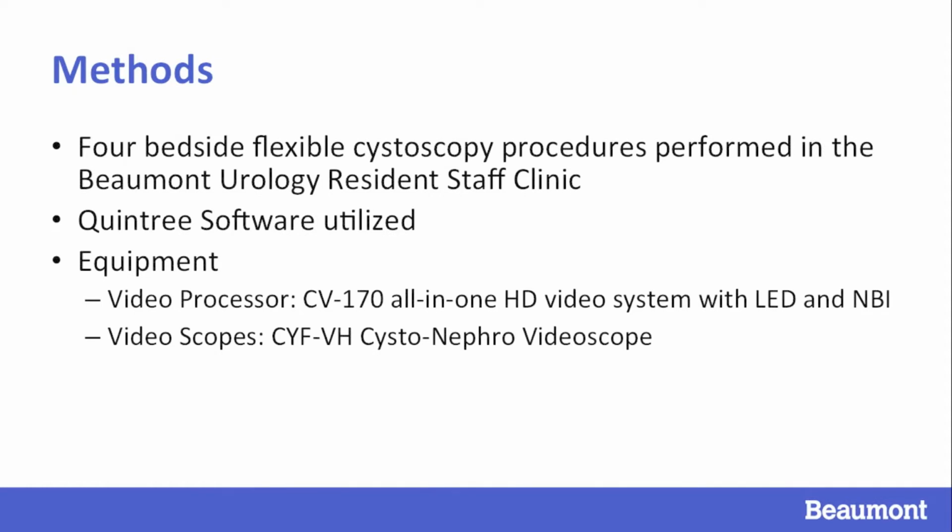In the William Beaumont Hospital Urology Staff Clinic, 4 bedside flexible cystoscopic procedures were performed. Indications for cystoscopy included as part of hematuria workup, surveillance cystoscopy for history of urothelial cancer, and as part of evaluation for worsening lower urinary tract symptoms in high-risk patients.